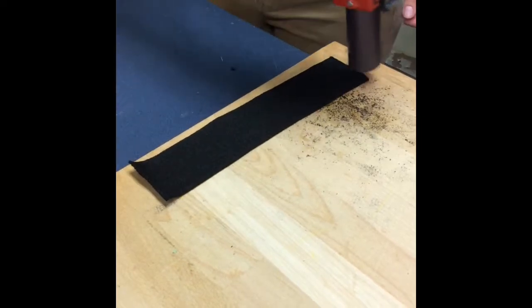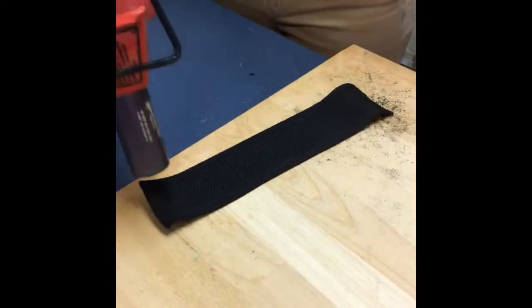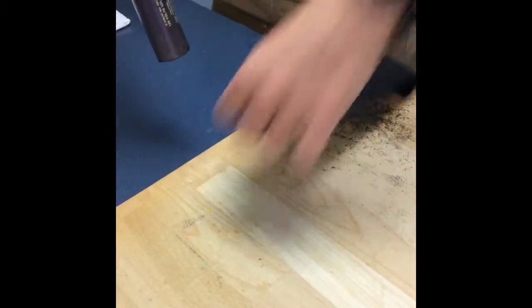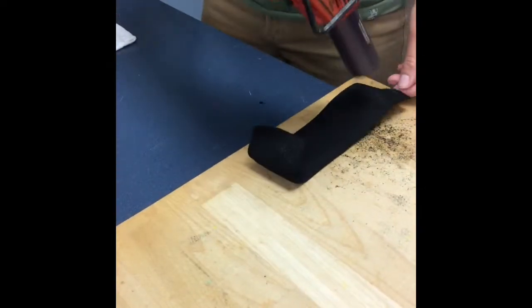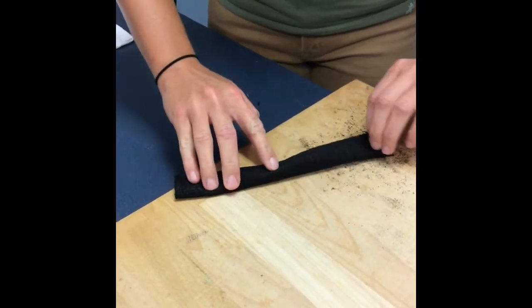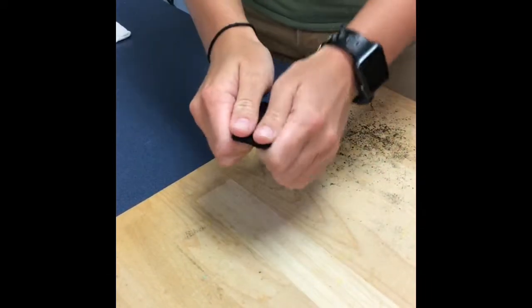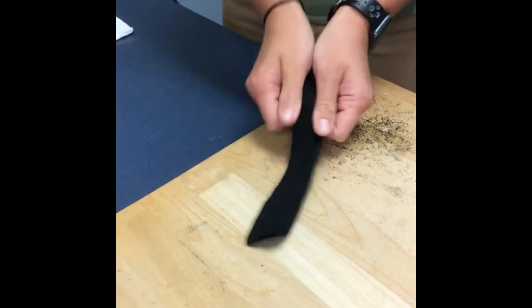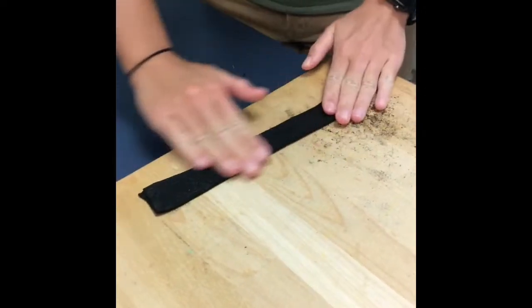Grab your heat gun and heat it up. It's okay if the ends curl. Then fold it in half, compress it down, and stretch it out. Once you stretch it out, you can heat it up again with your heat gun.